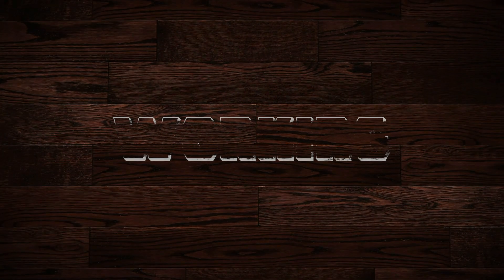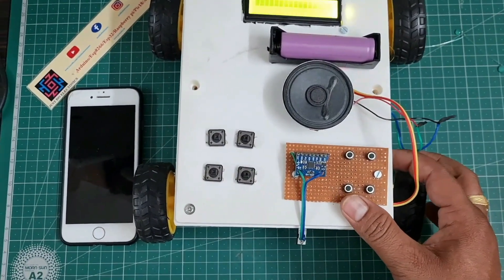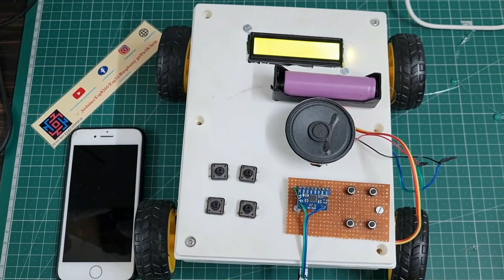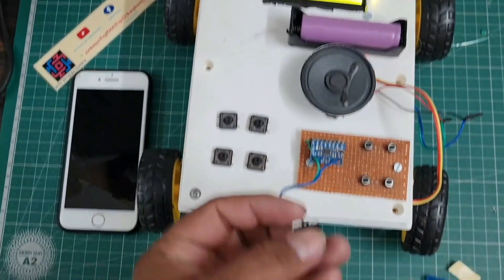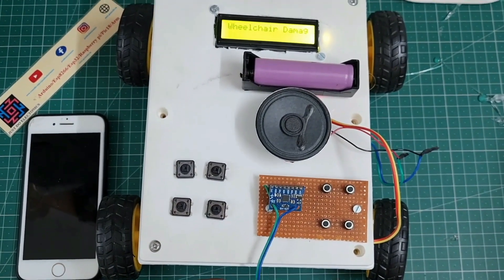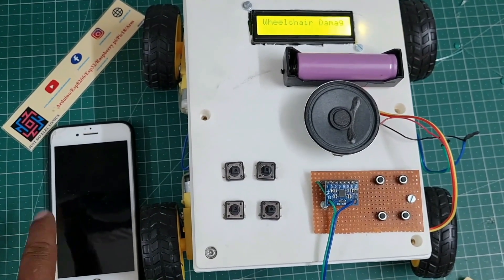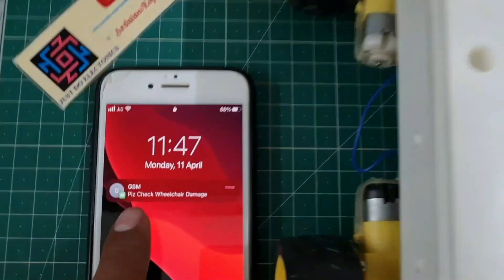Let's go and see the working of this project. First, I turn on the switch and the LCD will display a welcome message. This one is the limit switch — suppose when I press this limit switch, it means any person is sitting in the wheelchair and the wheelchair is going directly down the stairs. Then it sends a GSM text message: 'Please check — wheelchair is directly going down the stairs.'